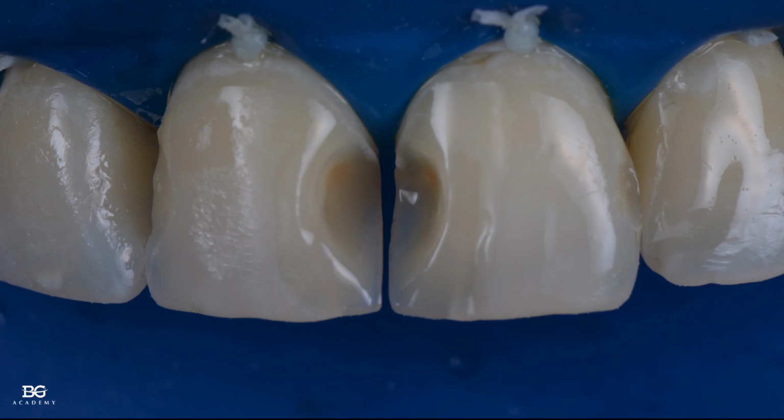So let me present this clinical case, or part of the clinical case. You can see here on the screen, teeth were treated because of the caries, class 3. Secondary caries, and now we are going to make our proximal profile, proper, better and easier.